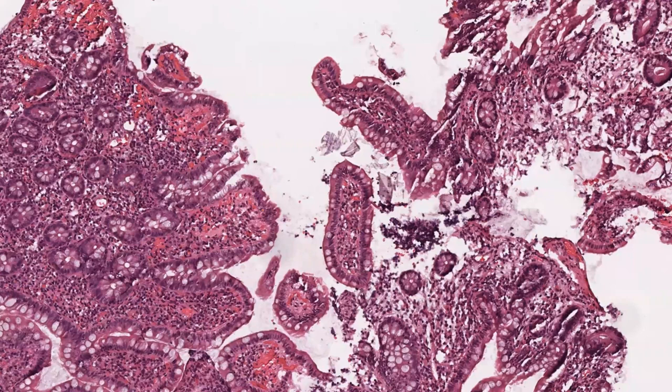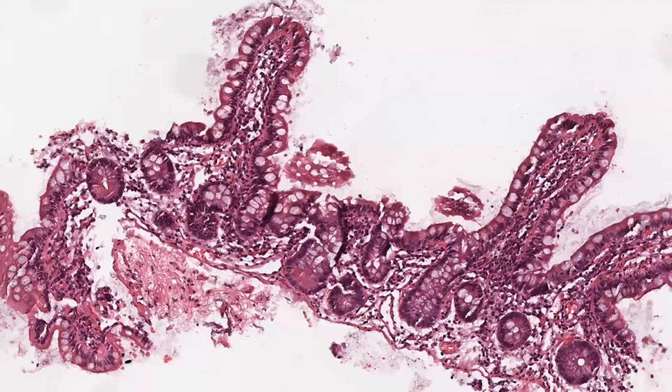We have to make sure that you can define this, yes? It is one of its basic features, it is still there. And it is important because you don't want to overcall the adaptive changes as chronic inflammatory changes.